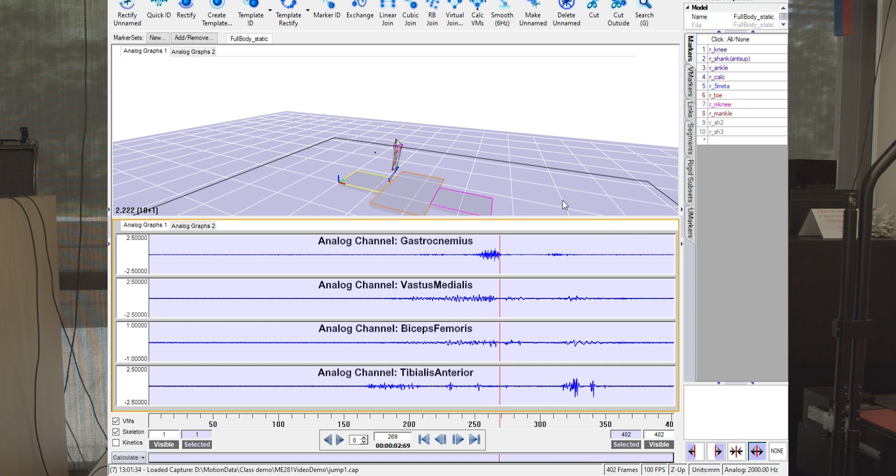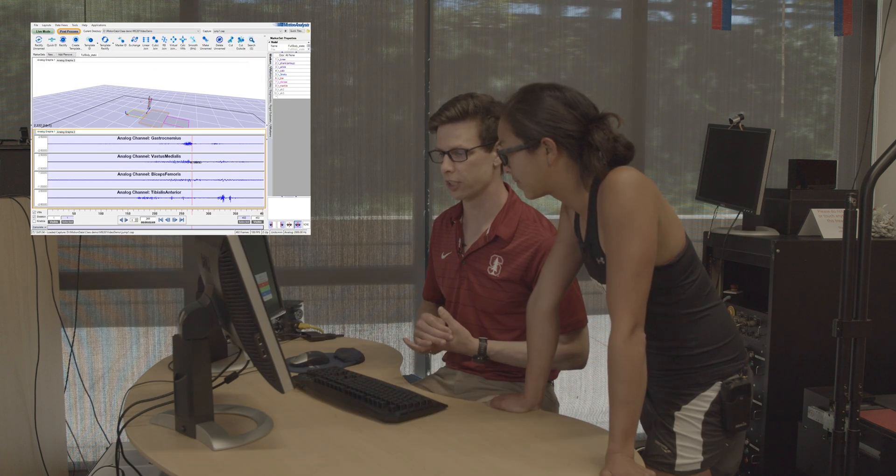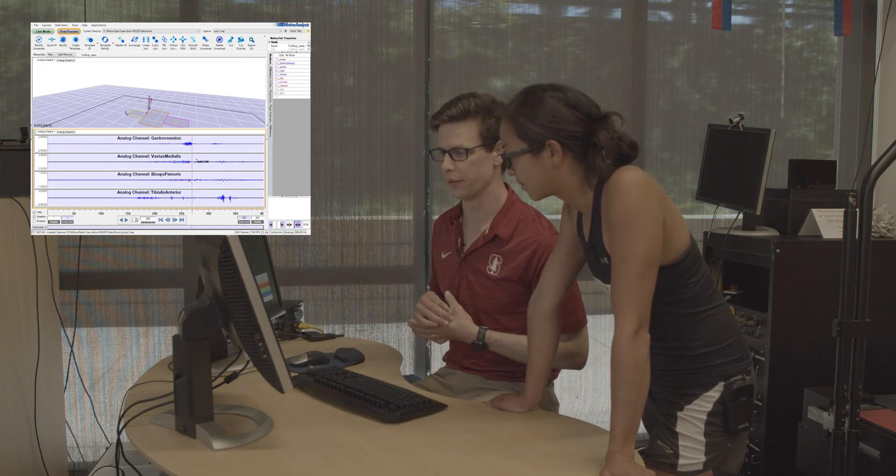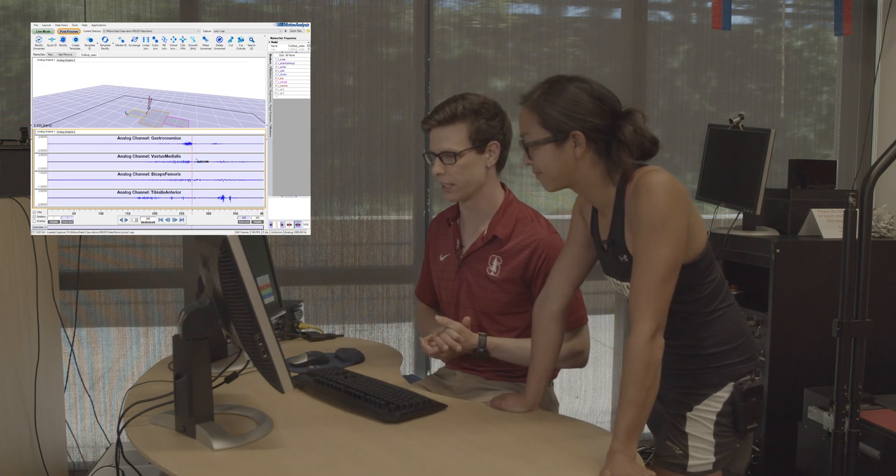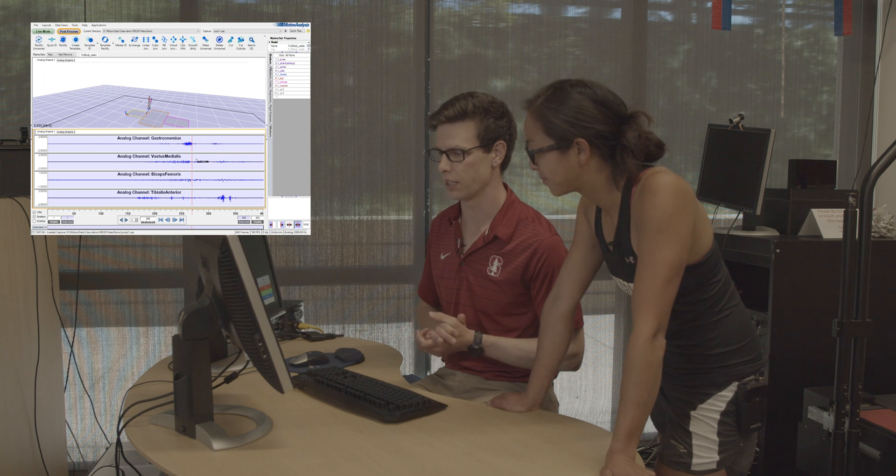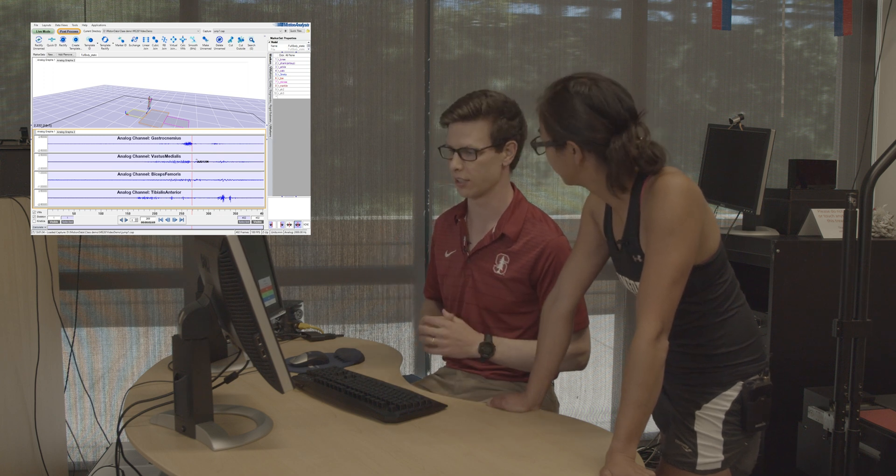Great, so that's what it looks like to take a motion capture experiment. And we could do this for walking or jumping or any activity that we wanted and have all these signals collected synchronously.